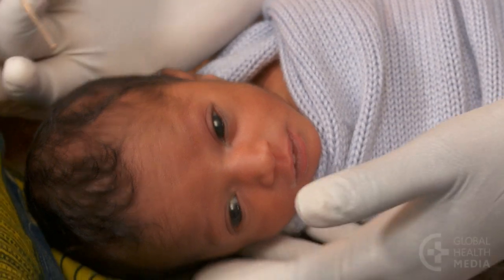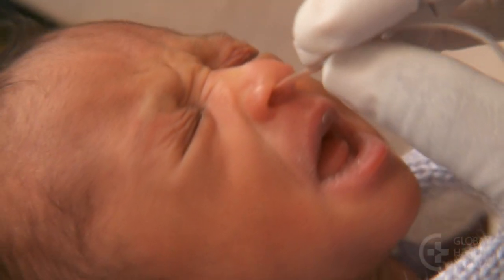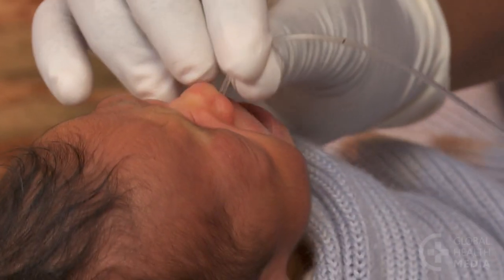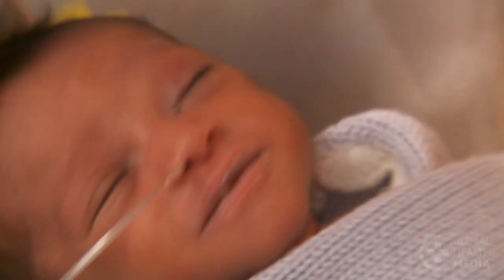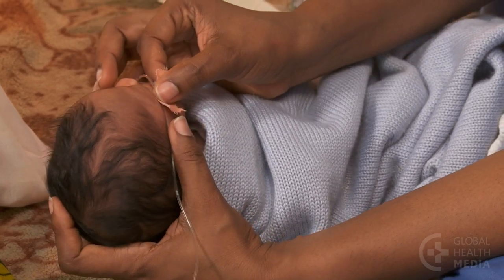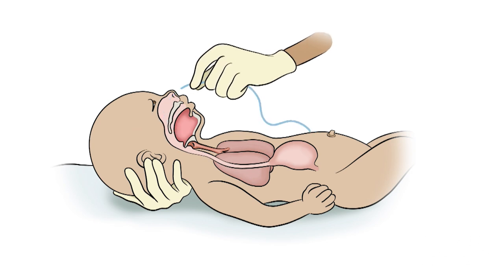Hold the baby's head still and flex his neck forward slightly. Gently insert the tube slowly and steadily. Aim toward the back of the head until you've reached your mark. The tube is uncomfortable for the baby as it's inserted but painless once it's in place. Never force the tube. If it doesn't slide easily, stop and try the other nostril or the mouth.